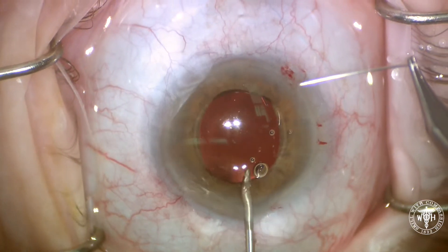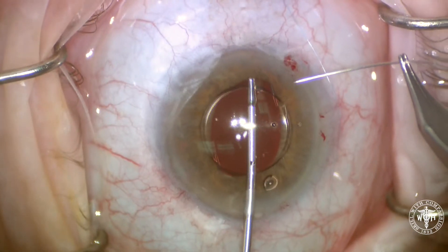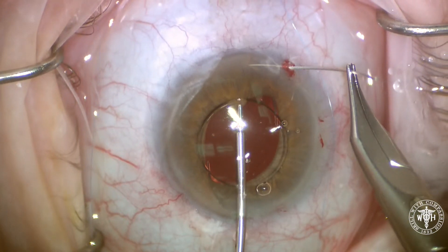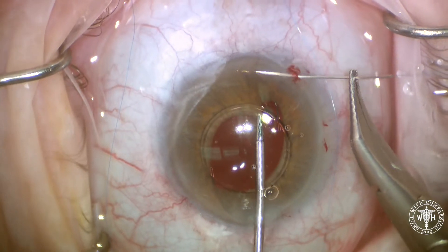The first thing we're going to do is capture the three-piece IOL by injecting some Miochol. Since I didn't get a very good miotic reaction, I'm actually grabbing the iris with a micro holder to put the iris on a little bit of stretch.